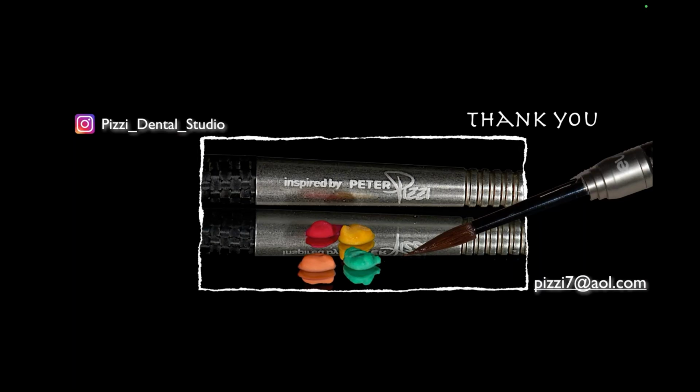Yeah, I mean, so the truth of it is yes. Sometimes the circumstance is I made a mistake and I built too much translucency in, and I'm trying to finalize my case, and I'm going to wind up going back and maybe mixing a little dentin into my enamel. I want a little bit more of a masking material. But yes, there are also times in real cases where, especially in single centrals or two to four units, you have these weird amounts of opacity that are very close to the surface.